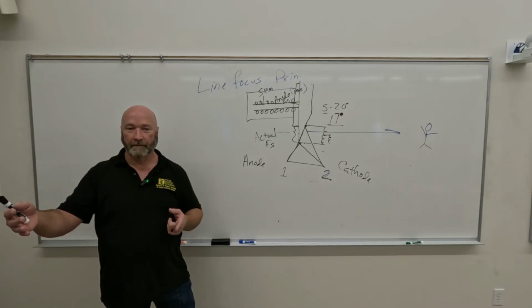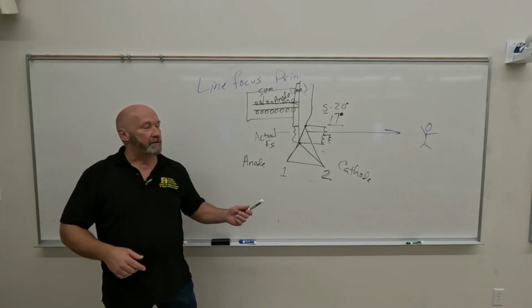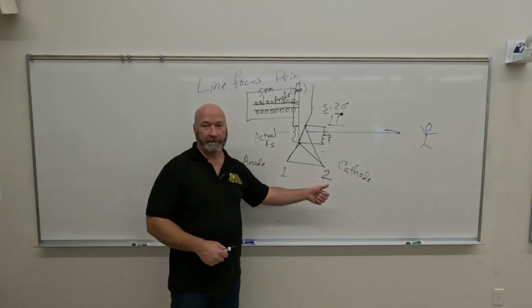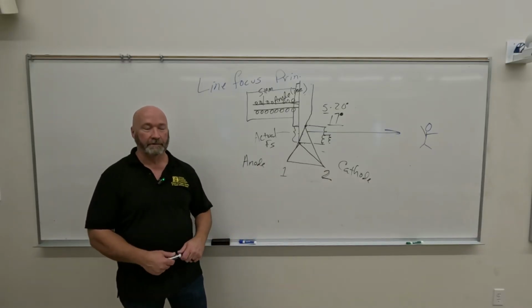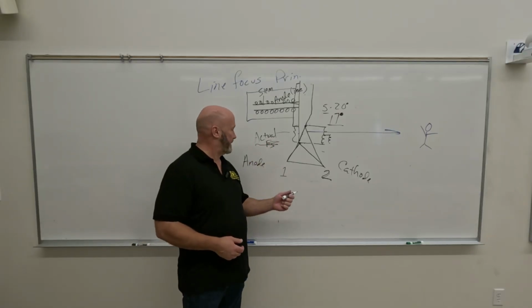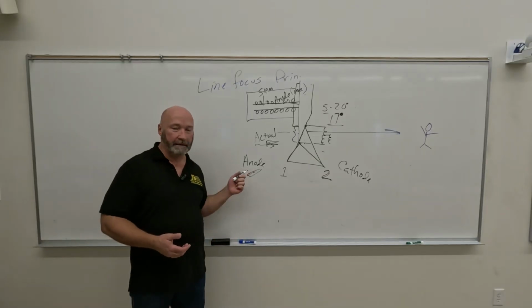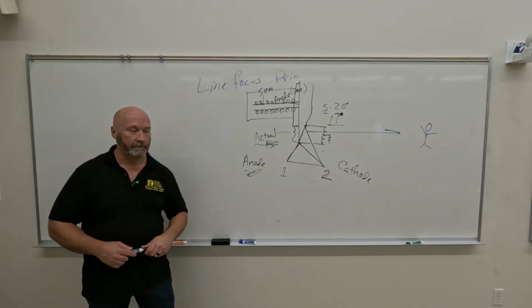Absorption of low energy photons is filtration, bingo. So in the anode heel effect, what provides the filtration? The anode itself is the inherent filtration that's creating the difference between the cathode and anode end of the X-ray tube.